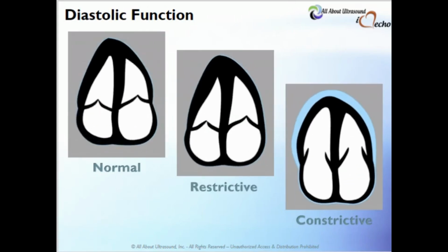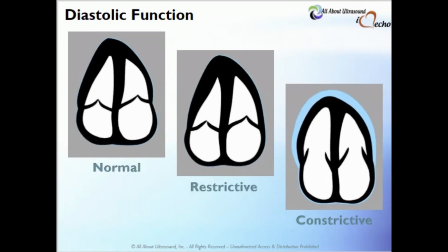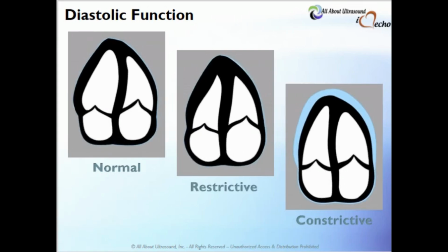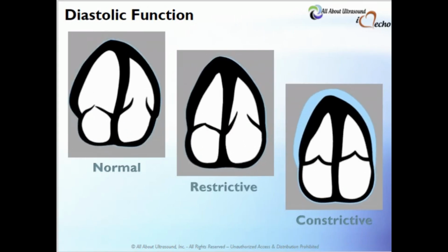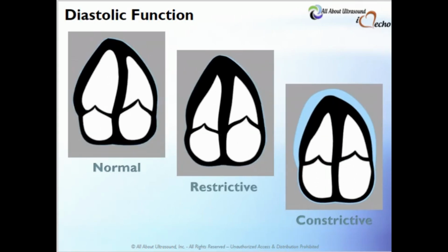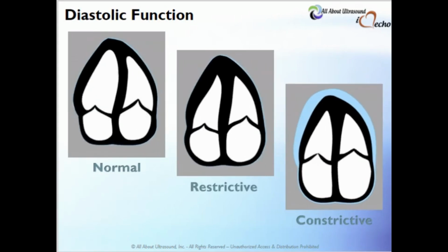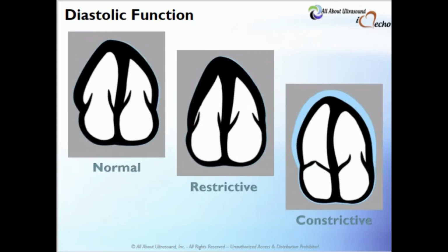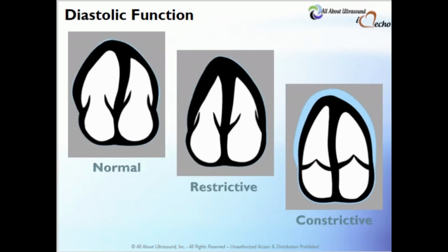And so the septal, the medial wall, or annulus at that point, when we're looking on tissue Doppler, overcompensates. And we call this mitral annulus reversus because the septal E prime velocity becomes significantly higher than it would in a normal diastolic function. And it's also significantly higher than the lateral wall.